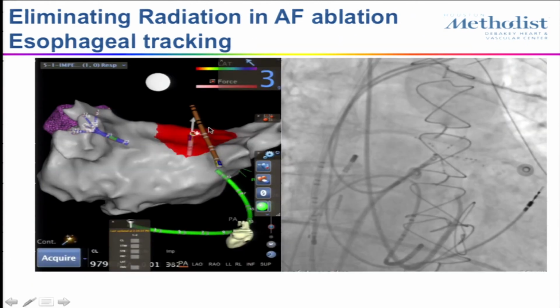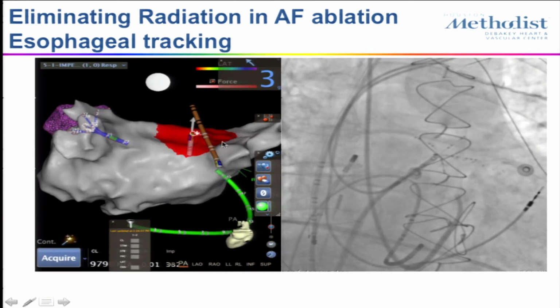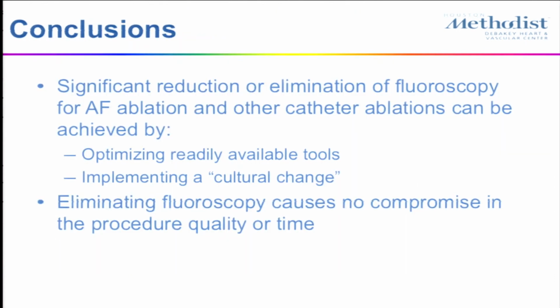Another piece of information, for safety purposes: one of the most dreaded complications of AFib ablation is damage to the esophagus. So we don't want to get there. So I needed to incorporate the esophagus into my map, so I don't need to X-ray. We used to put a temperature probe. So here is an aerial view. We have from the patient's mouth introduced into the esophagus a temperature probe. And here I have another catheter next to it. I see that catheter in the map, so I know where the esophagus is. And when I'm ablating close to the esophagus, I can go up and down and adjust the location of my temperature probe, so I make sure I don't overheat the esophagus when I'm ablating and avoid potentially fatal complications of this procedure.